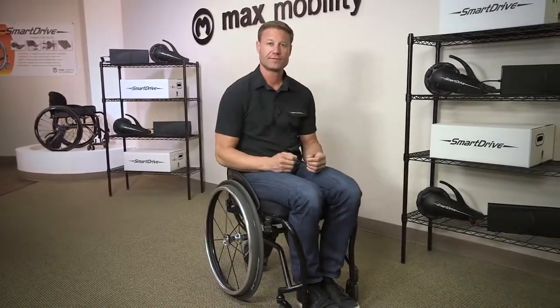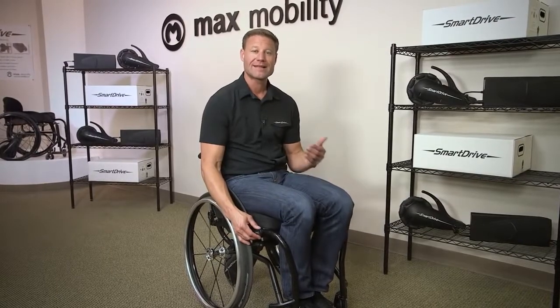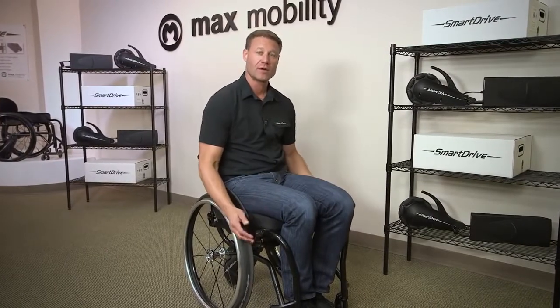Because you need to press a button to stop the SmartDrive, it's very important that you can quickly find and press one. To make sure you can do this, it's a good idea to reach out while you're cruising and feel the outer edges of the buttons. This will remind you where they are and make it second nature to reach out and press one in case of an emergency.